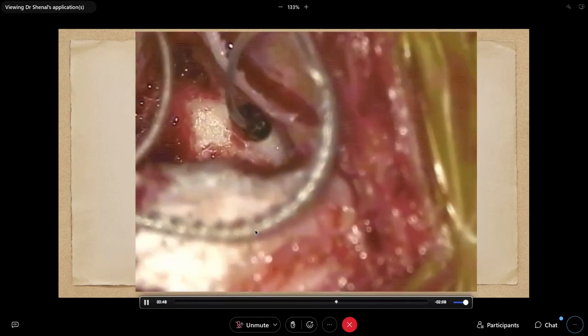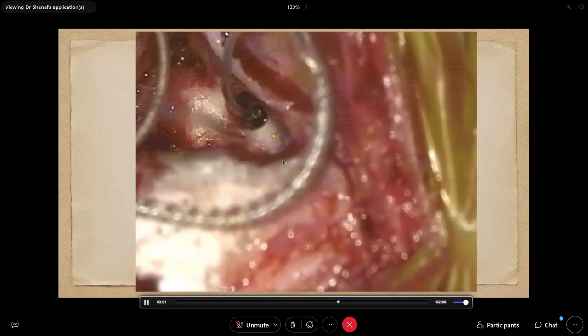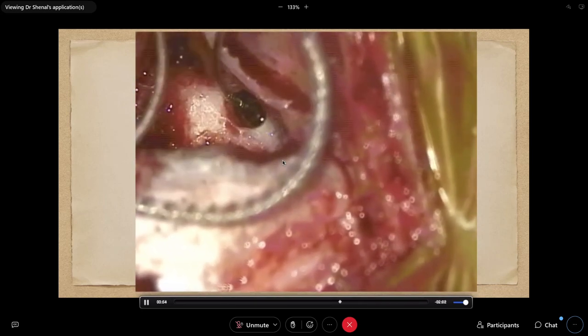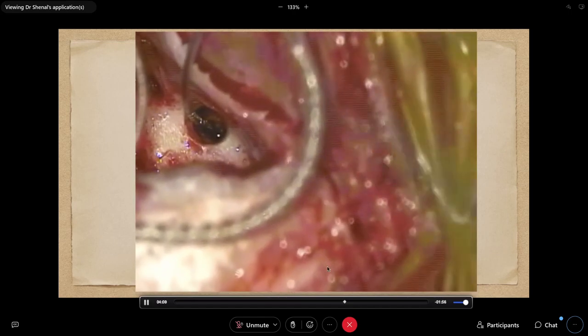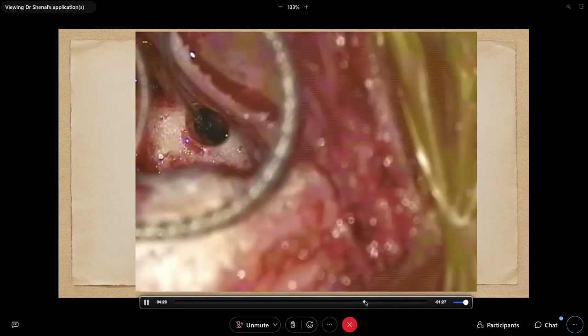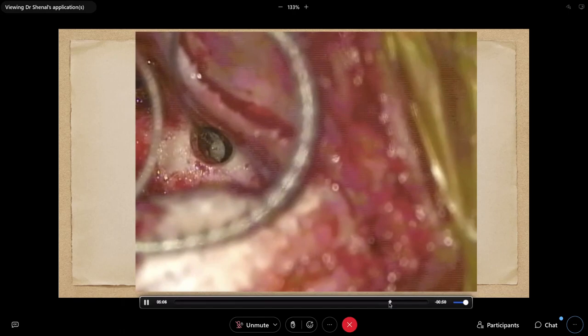So we'll put some fat there, the fat that we had already taken when we gave the incision. A part of it has come out. We'll again put it back completely in. Sometimes this bounce back is seen, so we have to reposition it. So this is the fat being plugged into the cavity. And see, now all around, we'll have this fat plugging.